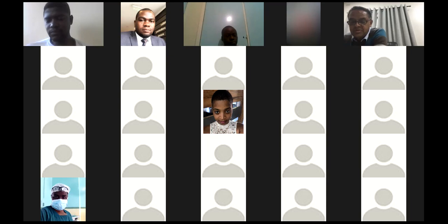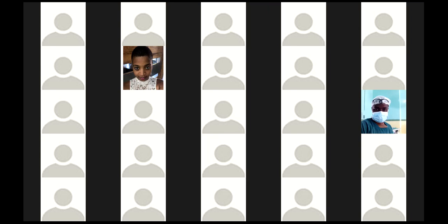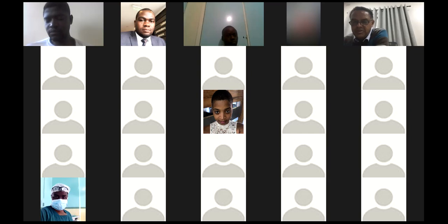So again, the important thing here is preoperative planning like you've never done before. And you have to work out, especially in our environment, whether you import a lot of various sizes of trabecular metal augments, various sizes of different acetabular cups, and sizes of much smaller stems. One of the patients I did, I actually had to use a pediatric femoral stem because it was so small. But I was able to predict that preoperatively by looking at the femoral canal, and I specifically ordered a stem that was three sizes smaller than the standard stem.